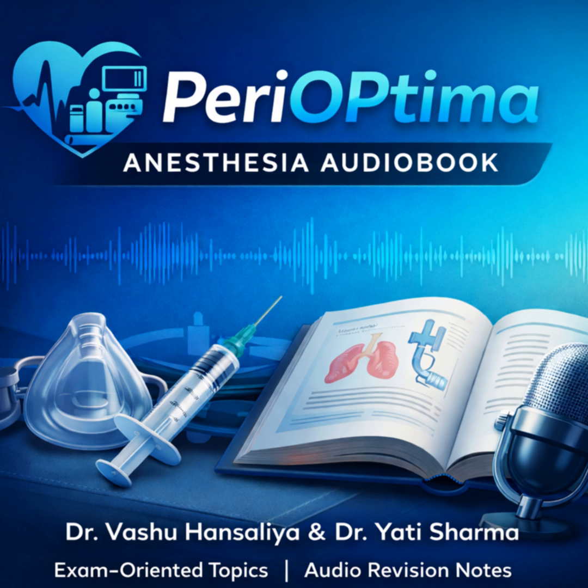That's a huge difference, almost 6 times the reserve. Exactly. And that buys the anesthesiologist critical time. It gives you minutes to detect and fix an MGPS failure before the patient's saturation starts to drop into a dangerous zone. It's the direct physiological payoff from good machine design.